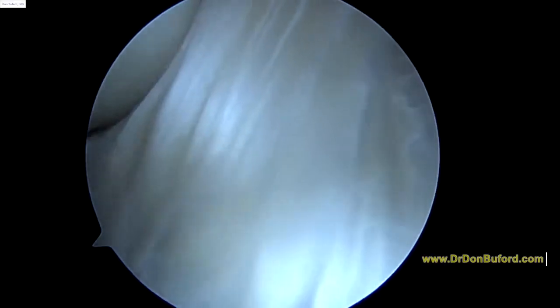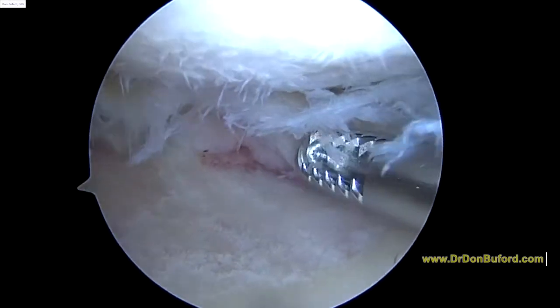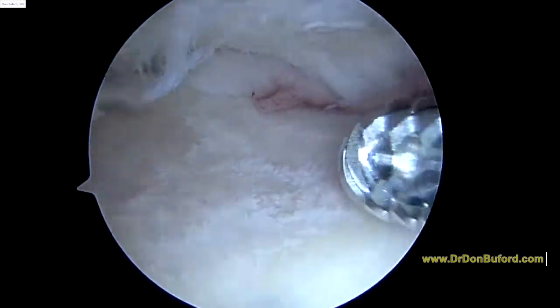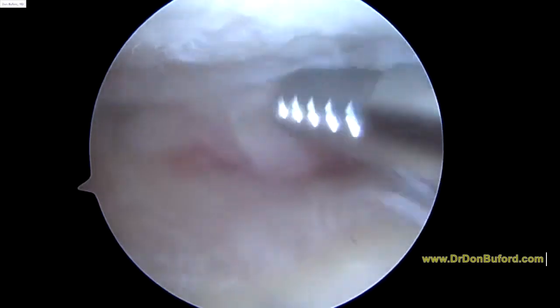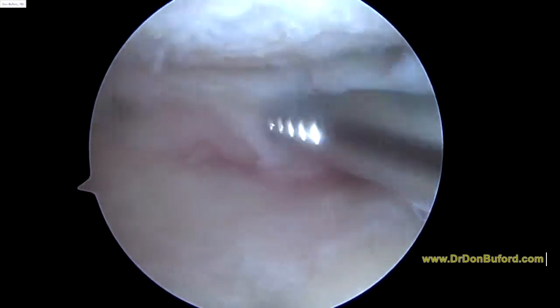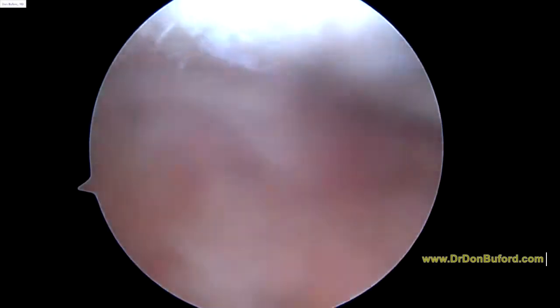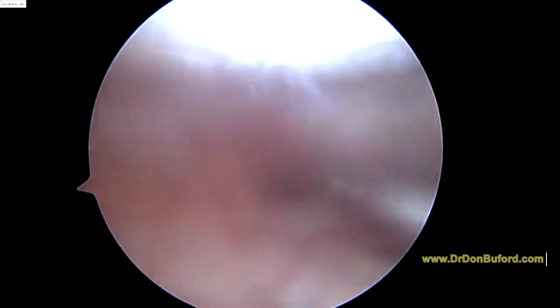We'll look at the lateral compartment next. So this is the lateral compartment — it is 180 degrees different from the medial compartment. Look how beat up this is. You're down to bone here. I know you're a little bit older than me — I think you're 53. So we're going to have to talk about some options to try and carry you on this knee while you're still working and trying to avoid any major reconstructive surgery like a knee replacement.